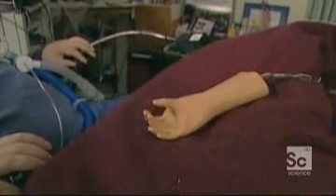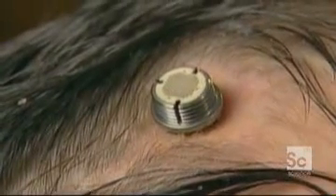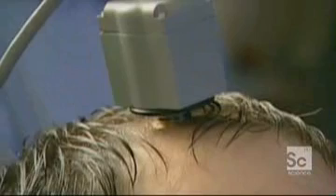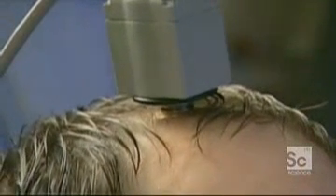Some fear that interpreting brain patterns that lead to a movement means we're on the way to reading people's thoughts. But Professor Donahue believes that's still a long way off. In terms of the ethical implications of BrainGate, we're sensing your intention to move, and we're sensing a little snippet, a tiny piece of the brain's own very elaborate process to produce the action you want to produce.